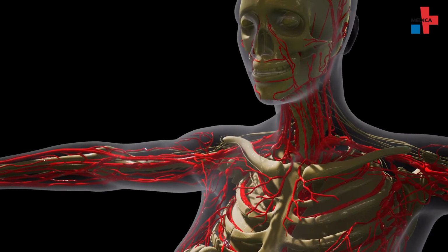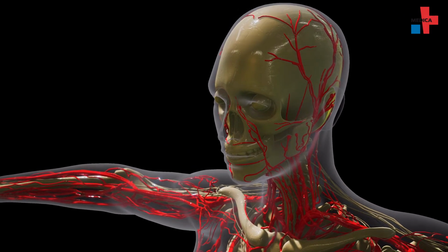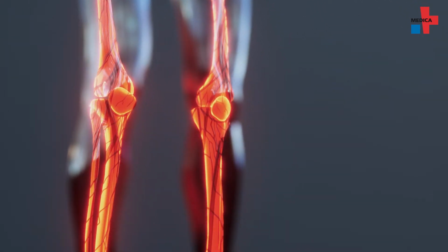The second point are vasculitides, and the most common form of vasculitis is giant cell arteritis. And patients with giant cell arteritis often experience sudden blindness. And our working group was able to design and print vessels of the temporal artery and the axillary artery, which are the two most commonly scanned vessels for diagnosis of giant cell arteritis.